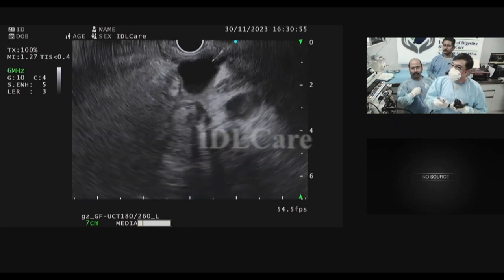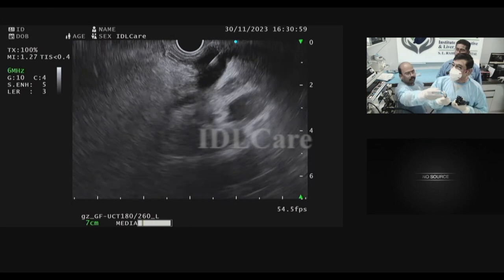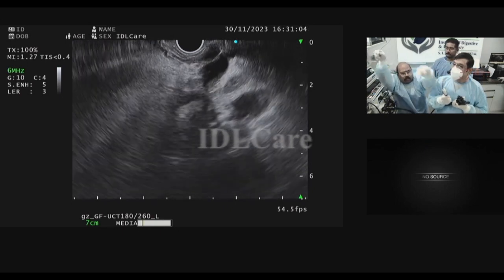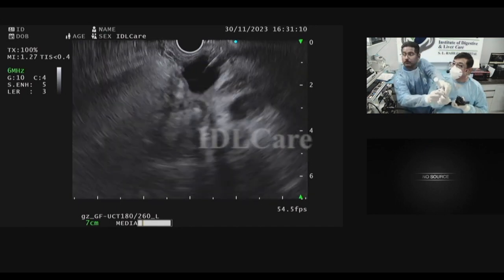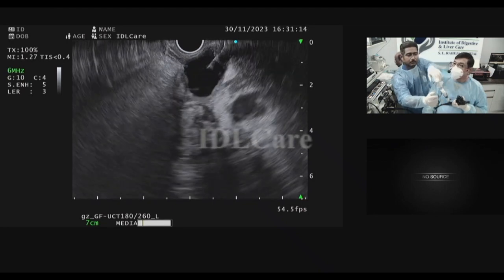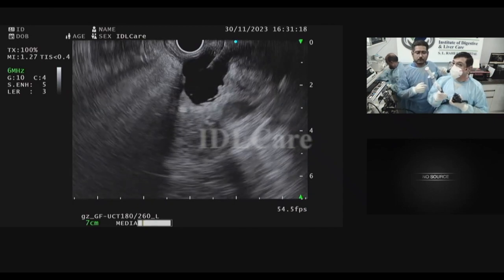See that? There. So I'm not able to get in. Now I'm in. Aspirate. Anything is coming?